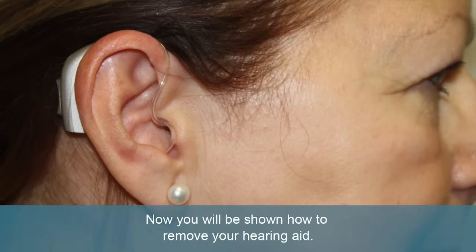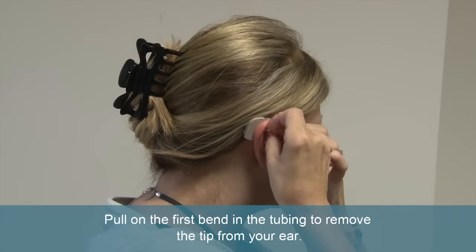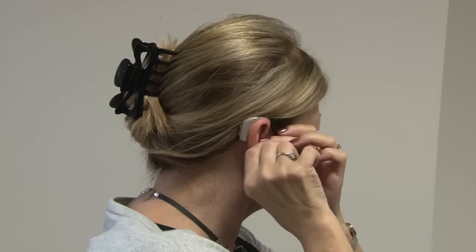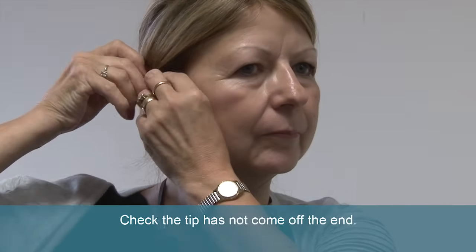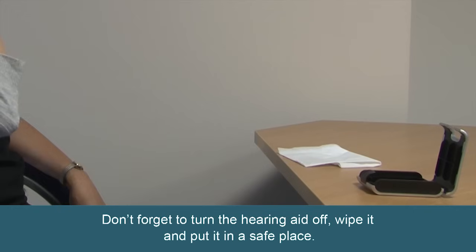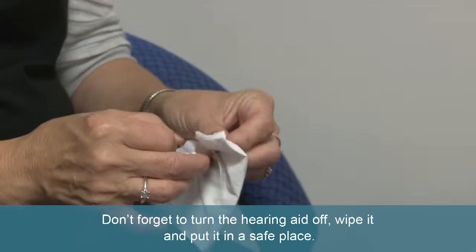Now you will be shown how to remove your hearing aid. Pull on the first bend in the tubing to remove the tip from your ear. Remove the aid off the ear. Check the tip has not come off the end. Don't forget to turn the hearing aid off, wipe it, and put it in a safe place.